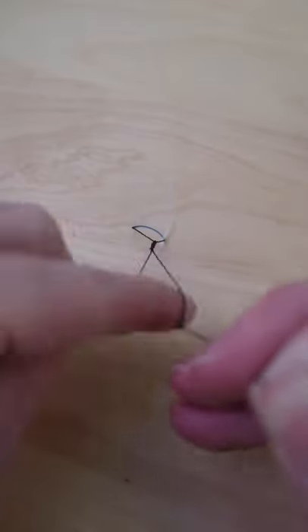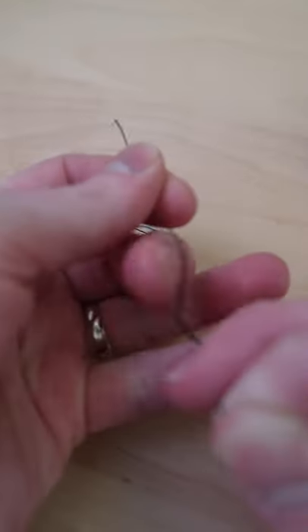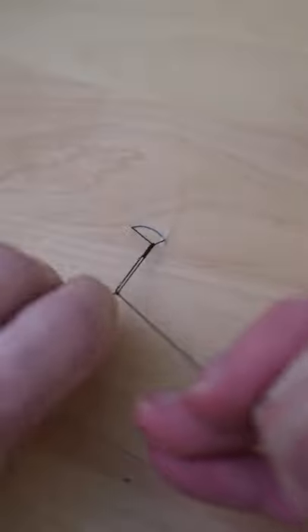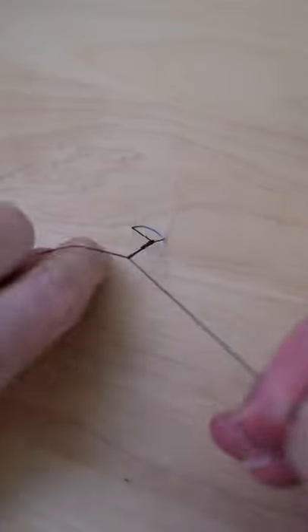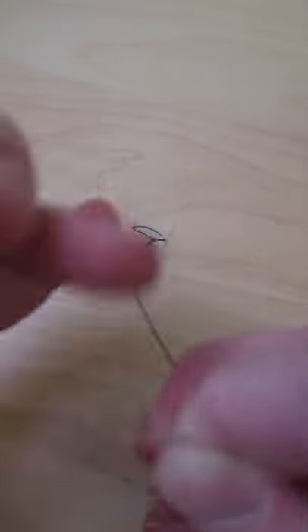I think of surgical knots as two motions — this is the forehand, and then this is the backhand. The first throw, you tuck your finger in through the loop and pull it down. The second throw, you flip it over your hand and pull it down that way. Tuck the finger in and pull it down. Flip your hand around and pull it down.